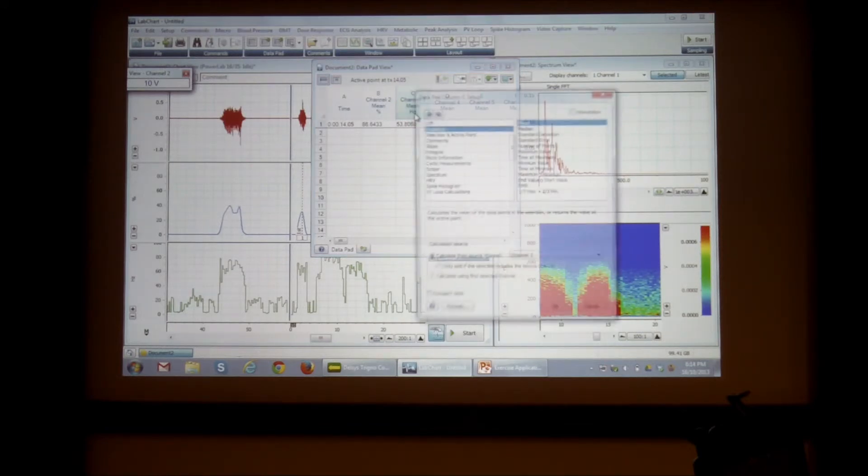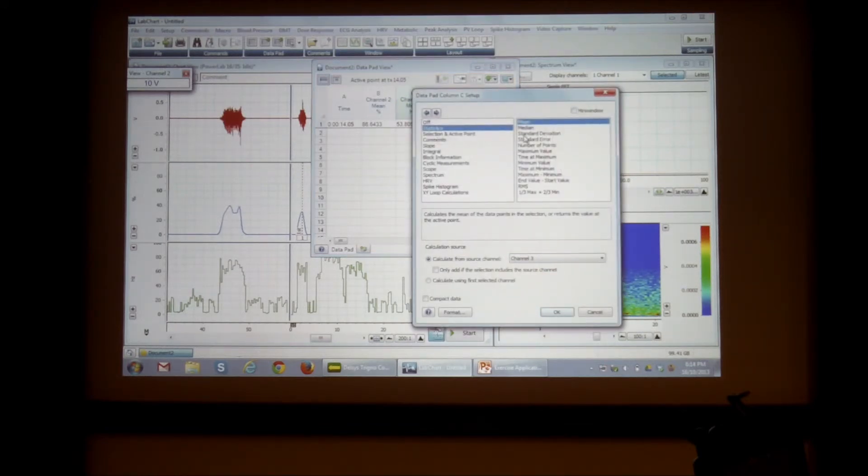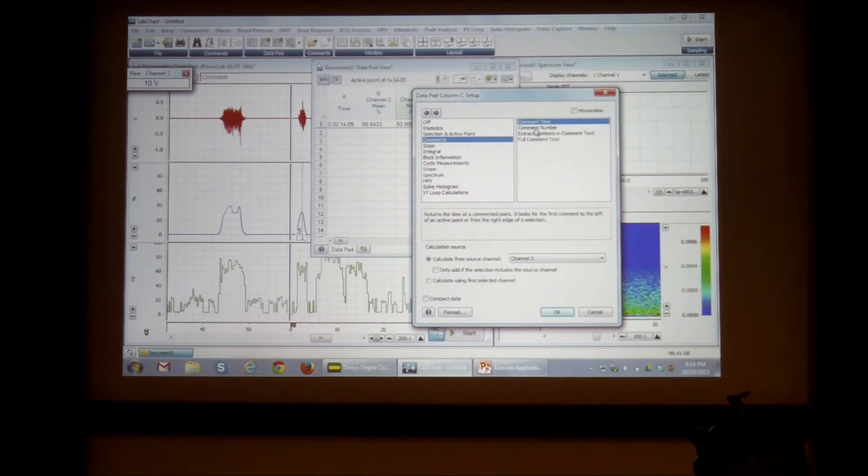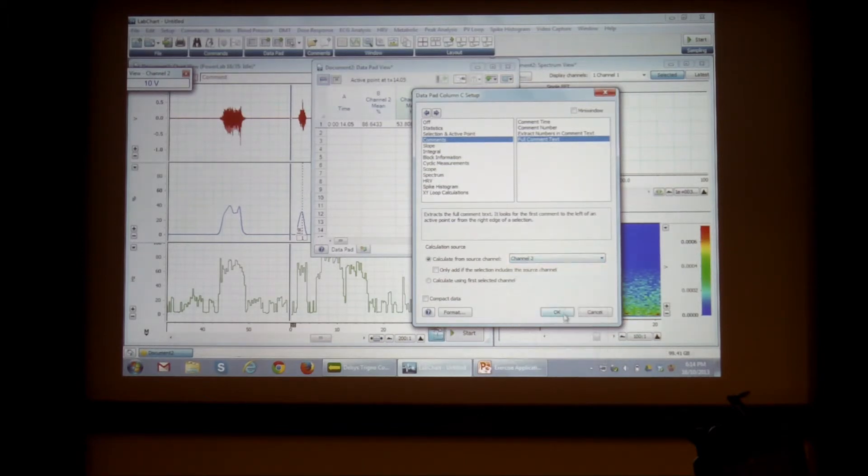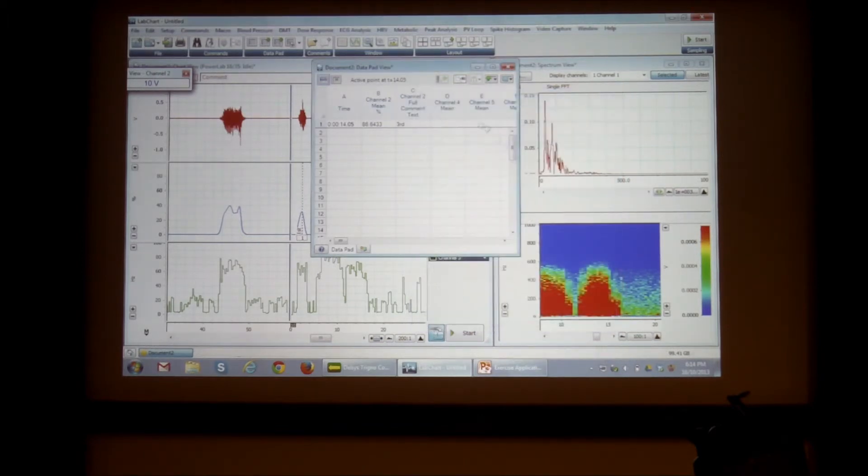And here I want to enter the text on my comment as well. I want to make some comments. And I don't want to edit the full, add the full comment text. And I should select channel two.